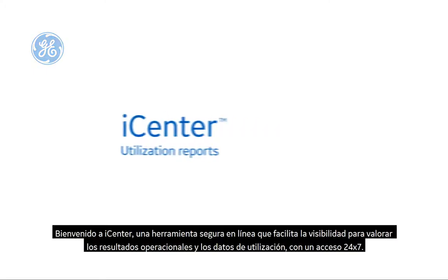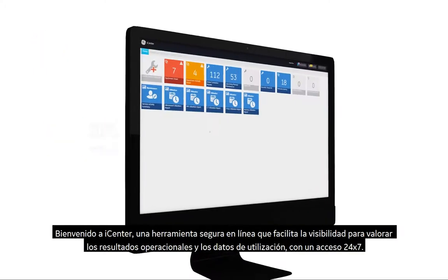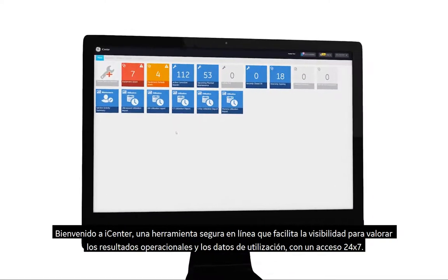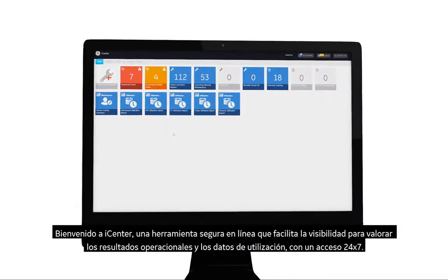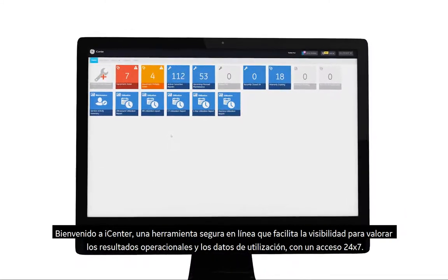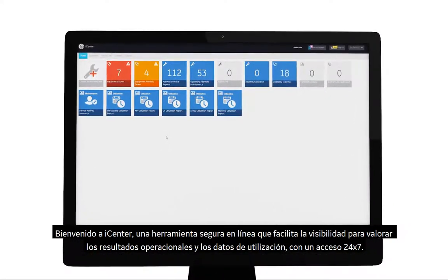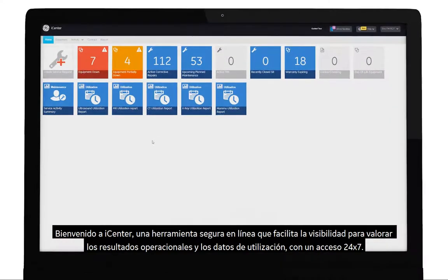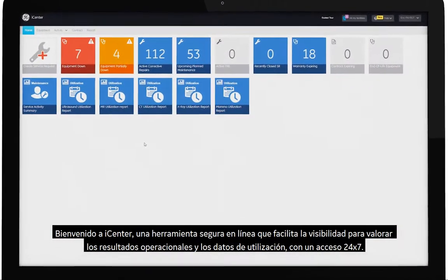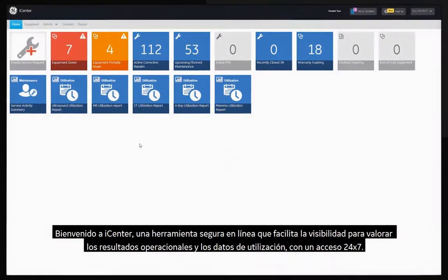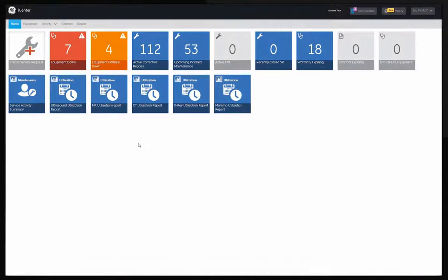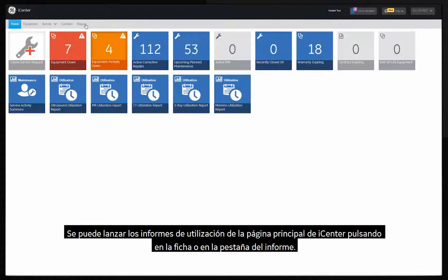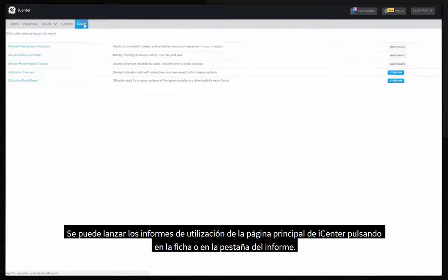Welcome to iCenter. iCenter is a secure online tool that provides visibility to asset operational and utilization data with 24 by 7 access.